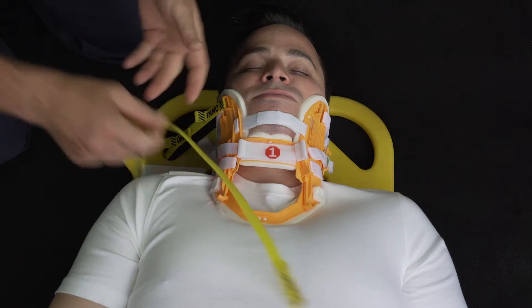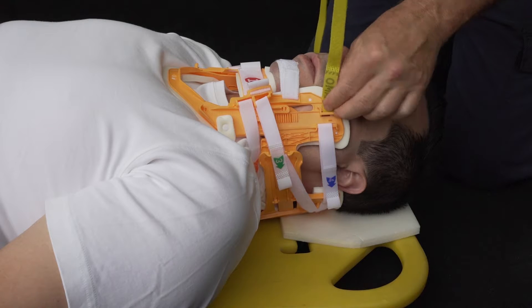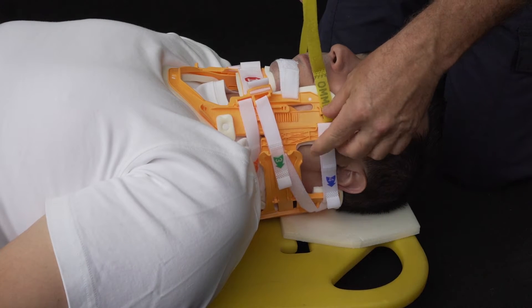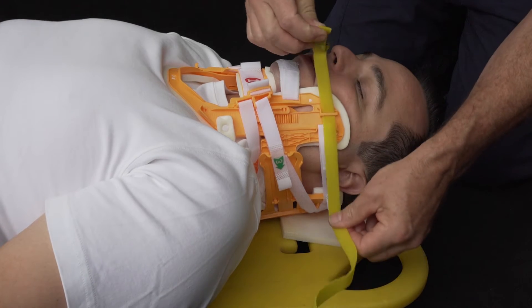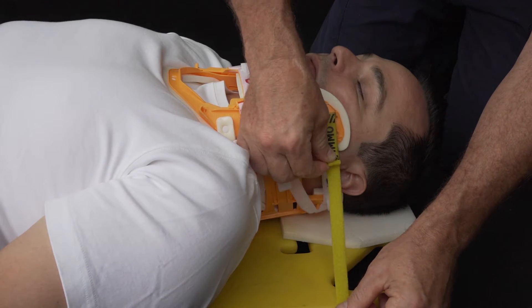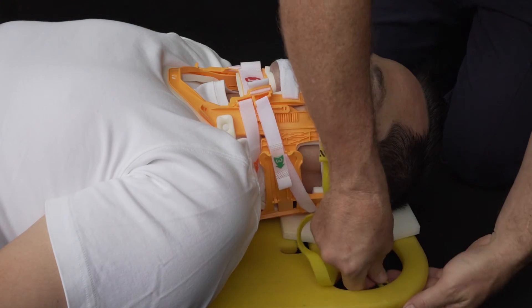Repeat steps on the other side. These straps can be loosened or tightened as needed during patient transport.